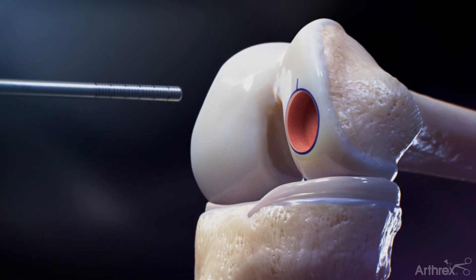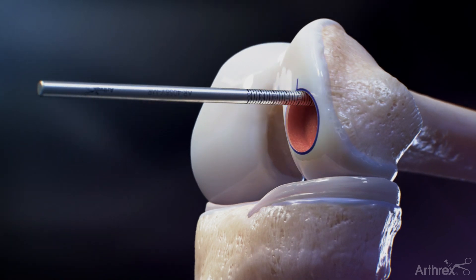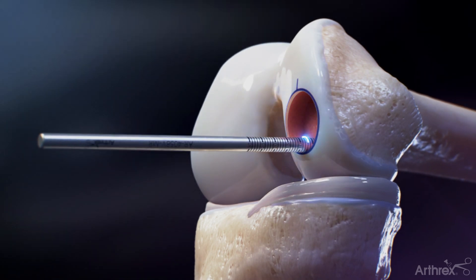Take depth measurements of the created socket from four quadrants and record them for use when creating the allograft core.